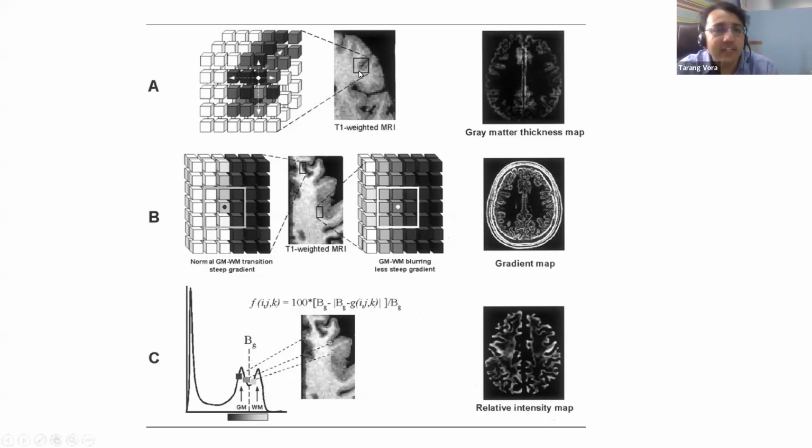Each voxel is going to have a different color depending on where the voxel is. If the voxel is in the gray matter, it will have a gray color. If the voxel is in the white matter, it will have a white color. If the voxel is at the junction of gray and white matter, then it will be a blurred voxel. So whenever we have a focal cortical dysplasia, abnormal cells producing some abnormal seizure-like activity, that is dysplastic tissue in the brain, we may not be able to see it on the MRI with the naked eye, but the voxel-wise distribution helps the computer identify any change from normal.